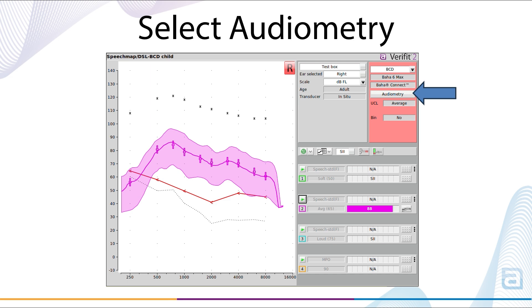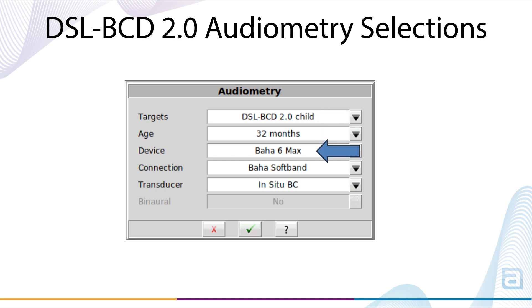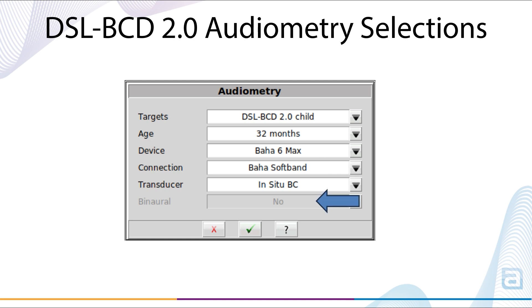To set DSL-BCD 2.0 prescriptive target parameters and enter audiometric data, select Audiometry. With the addition of DSL-BCD 2.0 prescriptive targets, the Audiometry menu in Verifit 2's SpeechMap now has the following selections: targets, age, device, connection, transducer, and binaural.